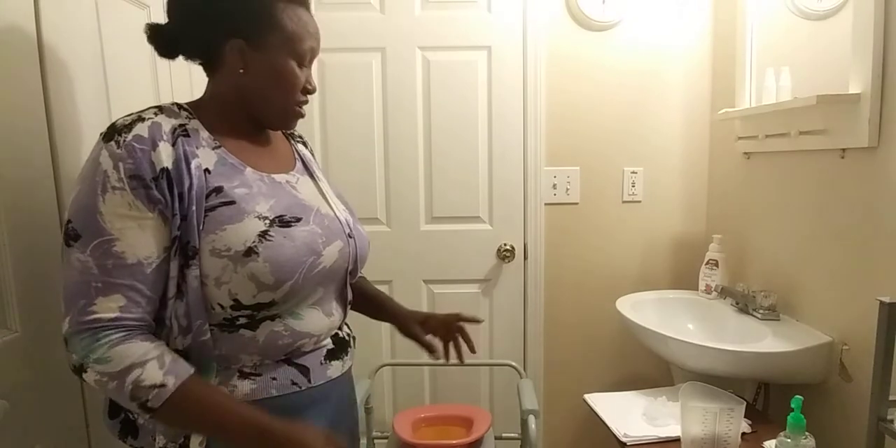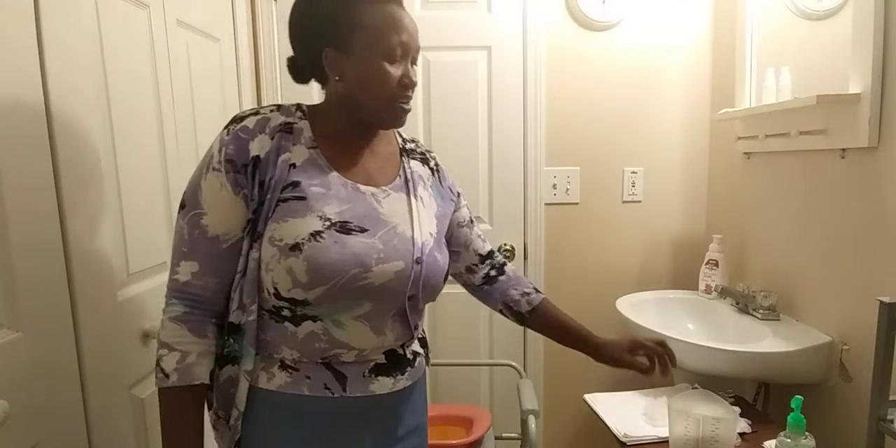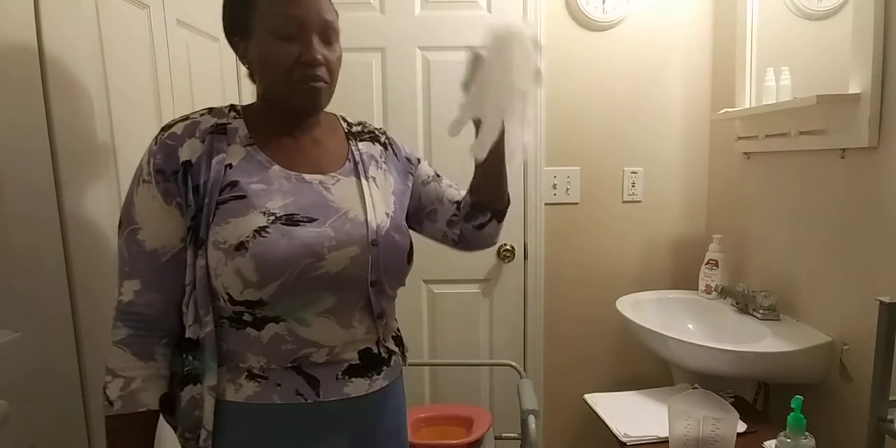Welcome to the CNA skill adventure. I'm going to be demonstrating the CNA testable skill: measuring urinary output. The urine is going to be in the bedpan, and the only things you need for this skill are a measuring container and a pair of gloves.